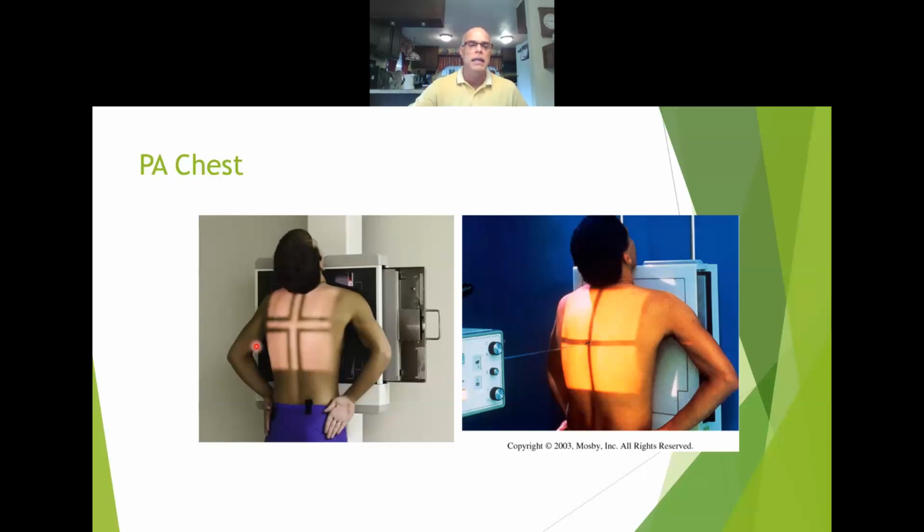And again, you can see this is where they're talking about. This is your MSP. Right over the spine, you can just run your finger across their back and center them up perfectly, because those little bumps on the back as you run are called spinous processes coming off of your vertebral bodies.